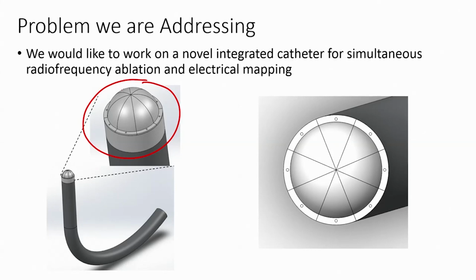Through this external tube we can give the RF frequency, and we can also make it conductive, so the length of the tip increases. This section can be used for RF ablation, and when the tube opens up, another catheter from within will come out and be used for electrical mapping. That is our idea.